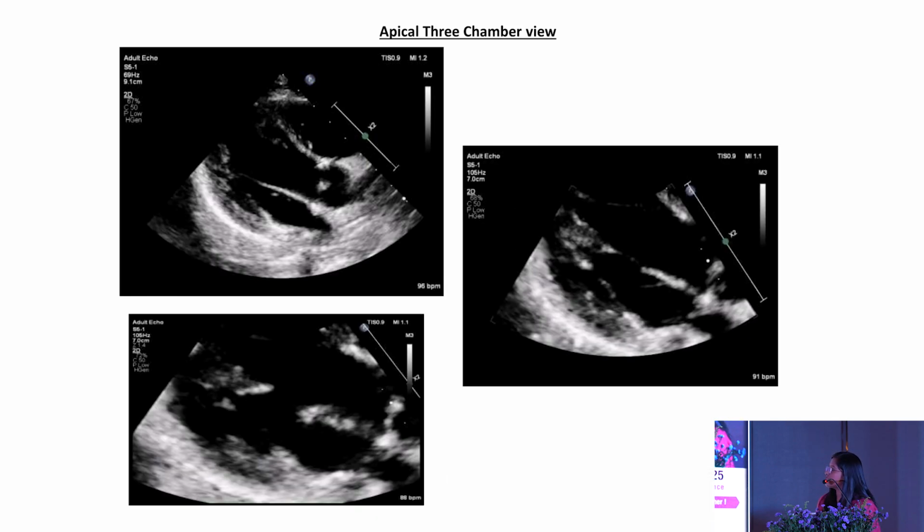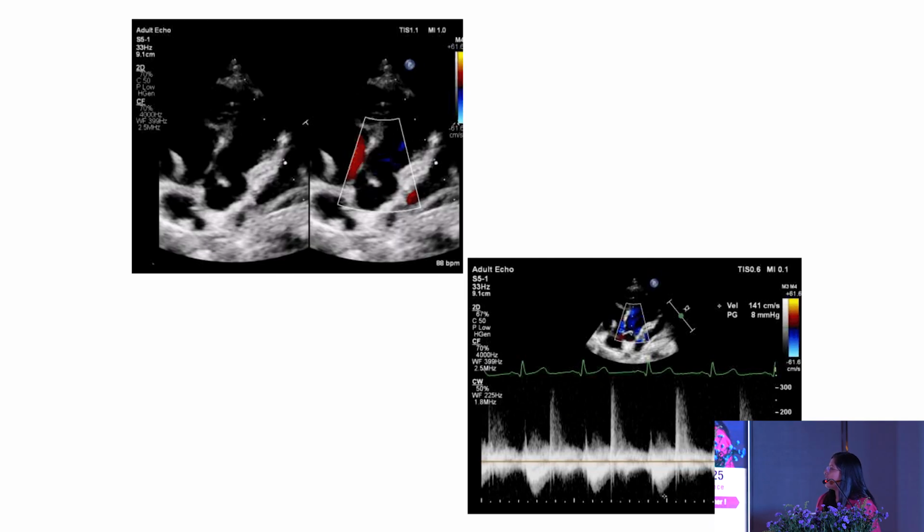The 3-chamber view of the heart shows the exact movement and positioning of that linear structure, which is freely dancing inside the heart with every beat. The aortic valve shows mild aortic regurgitation, and a focused view of the RV shows mild tricuspid regurgitation and mild pulmonary artery pressure.